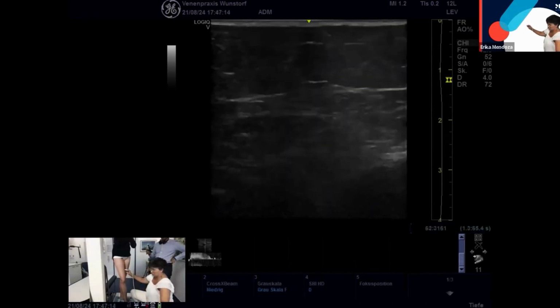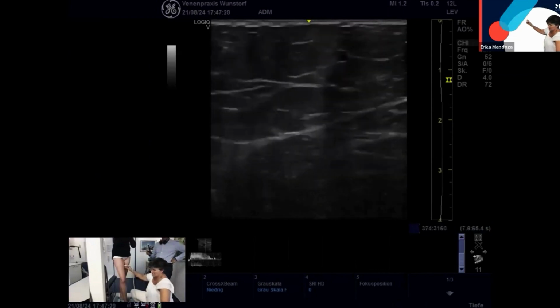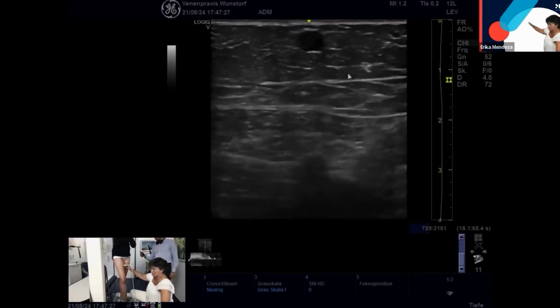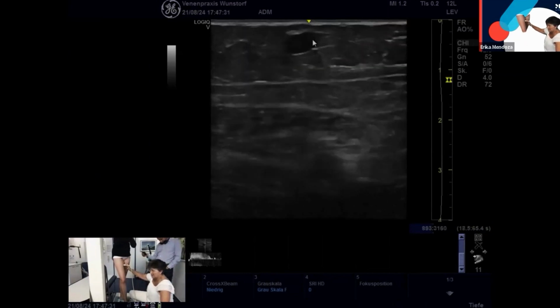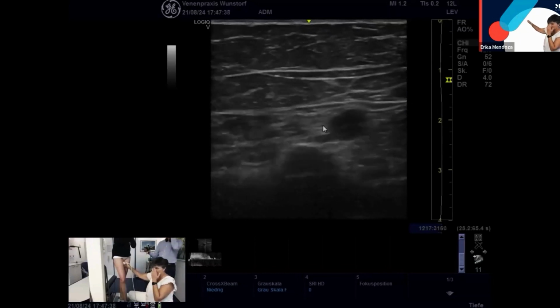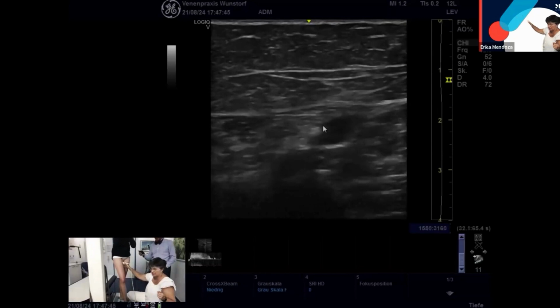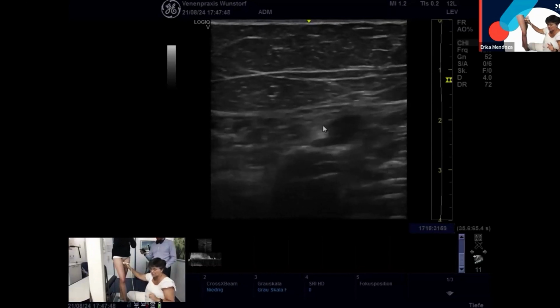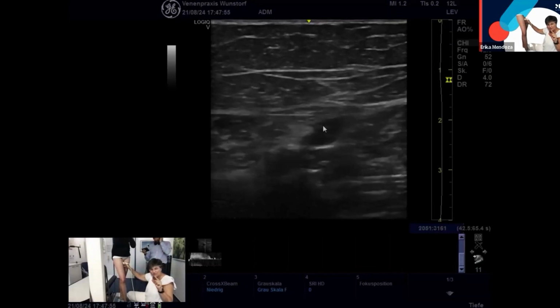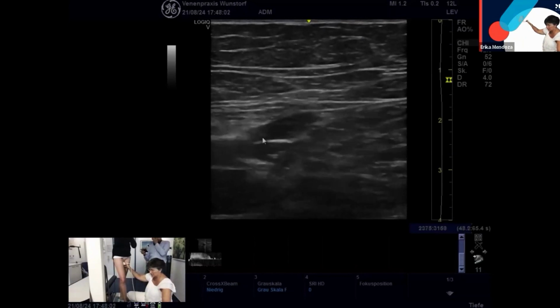So my option will be to approach the tributary at this level, just before it enters the fascia. Here I will go inside it with a needle, and I will inject foam. I make a very dry foam, for these occasions. This is 1 part of 3% polidocanol and 7 parts air, not 1 to 4, but 1 to 7. This is the dry foam, and you make a very hard foam. You can really see how it moves, and you can stop the injection when the foam reaches this line, just before this junction.